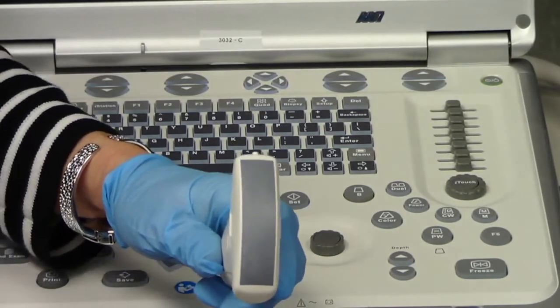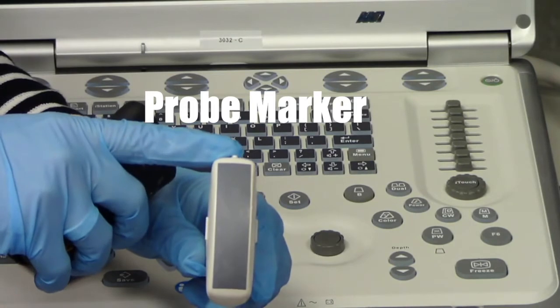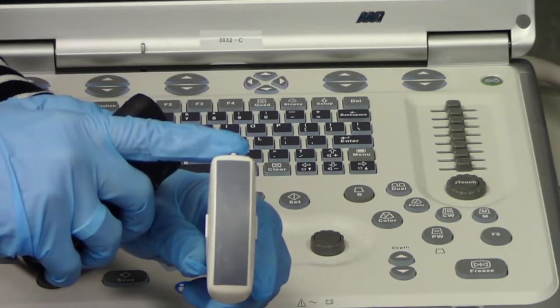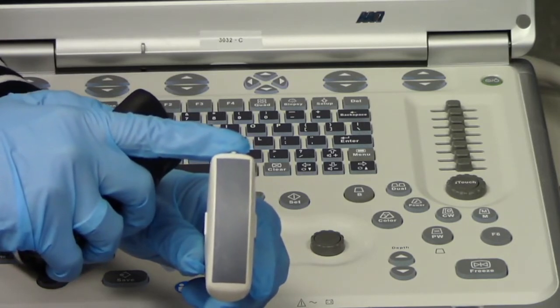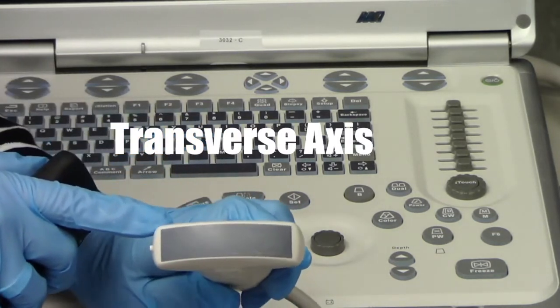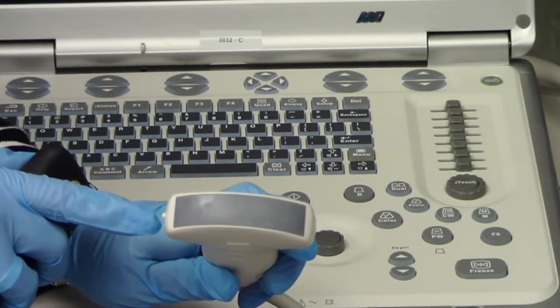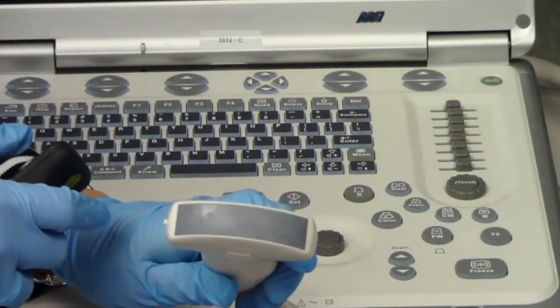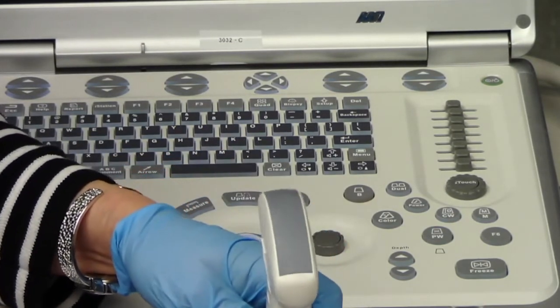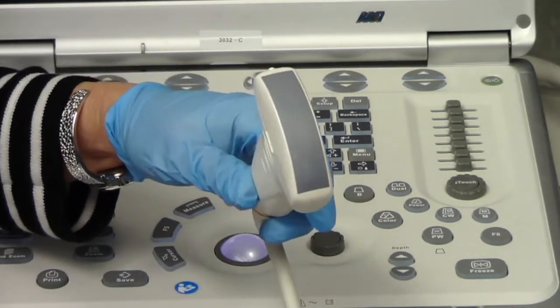If we move back to our probe, let's remember that we have the probe marker up here. And so in long axis, you want that probe marker pointing towards your patient's head. And we do a 90-degree turn in transverse axis, where we point to the patient's right, and that's going to be your transverse images that you'll acquire. The probe movements are going to be heel-toe, just like we have done in the previous ultrasound sessions, and sweep, and pivot.